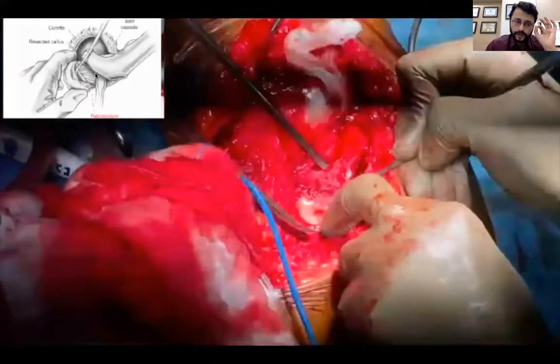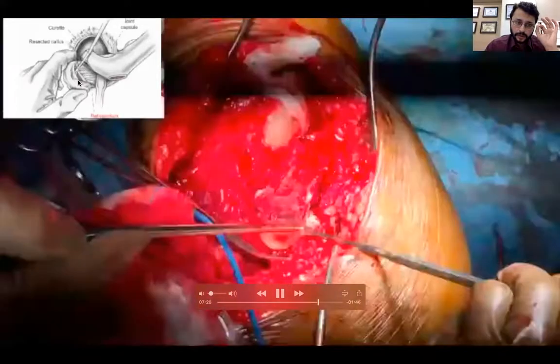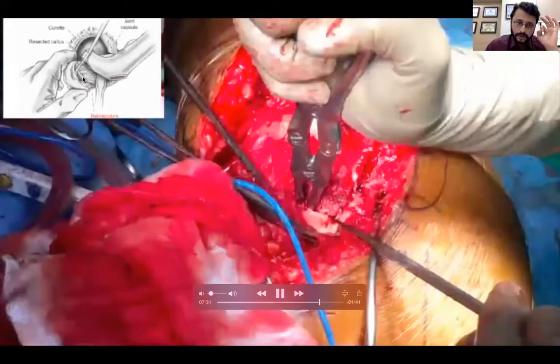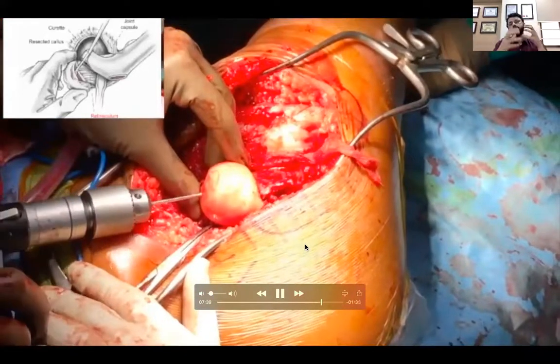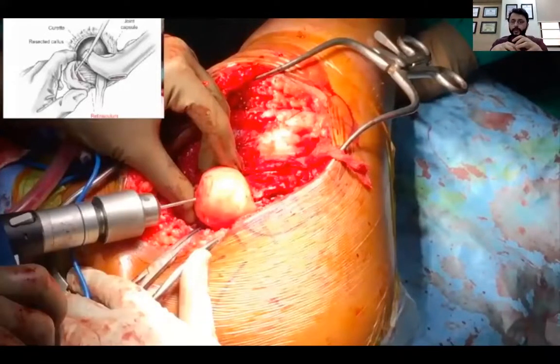The entire metaphysis is devoid of all periosteum. The epiphysis is completely curetted. The posteromedial callus is completely removed. Only then will I be able to get a reduction like this. So once everything is released, then it's just a simple repositioning of the femoral head. It should be without any tension.